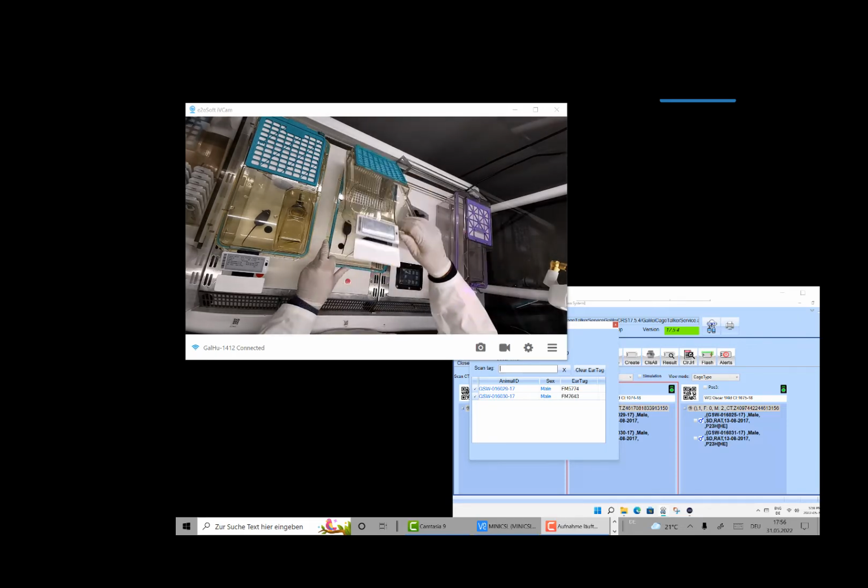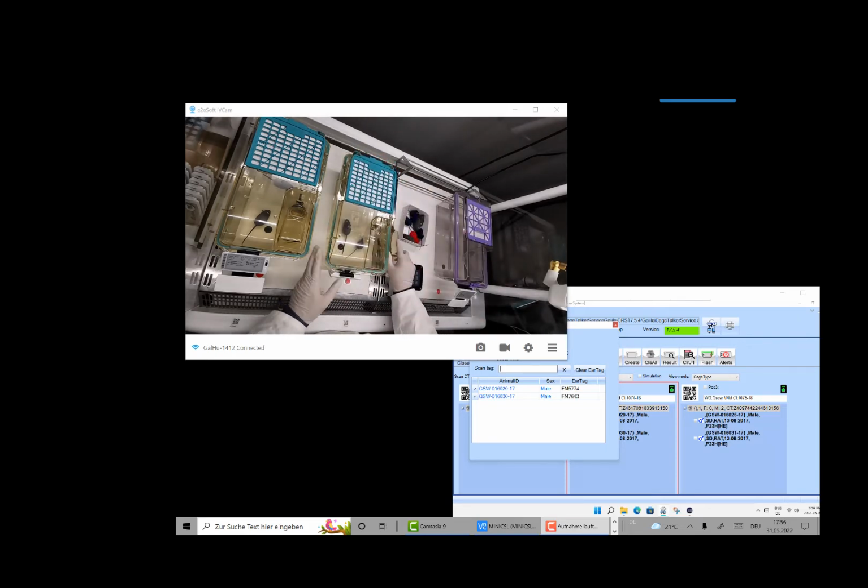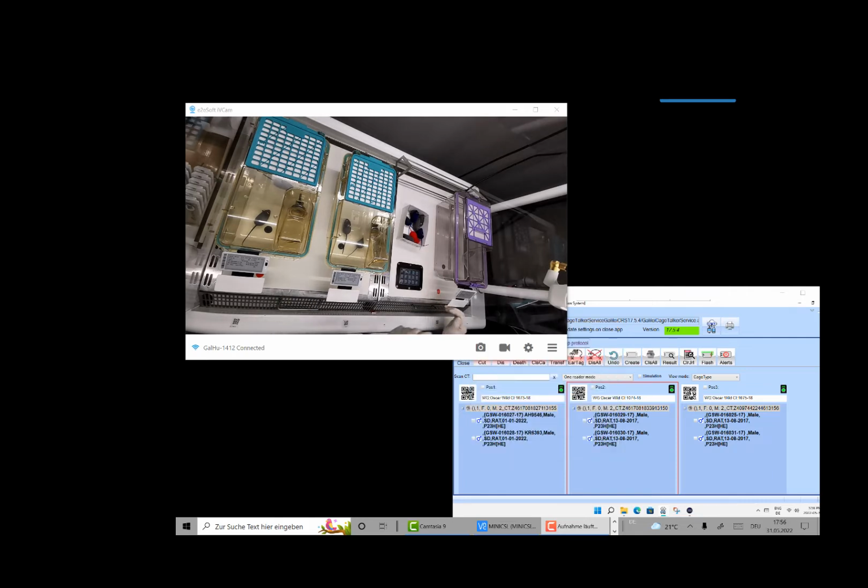Okay, we close the cage, put the pressure buckle, say OK, and we go.